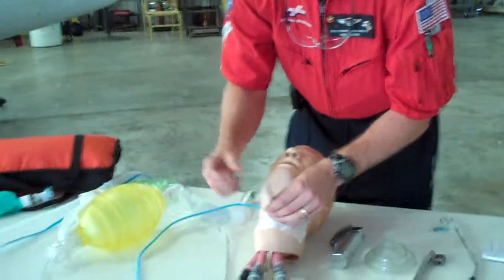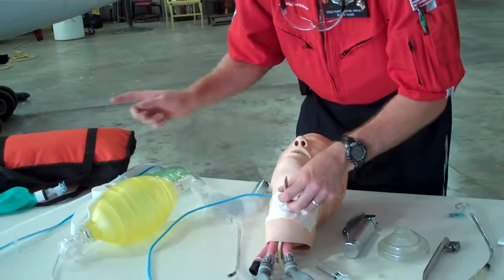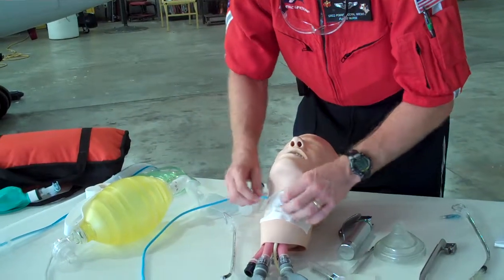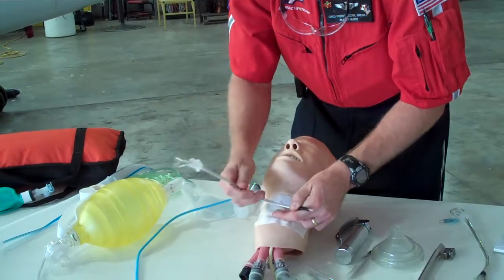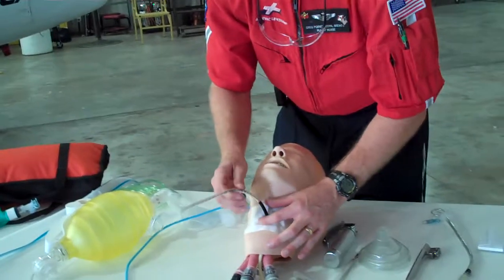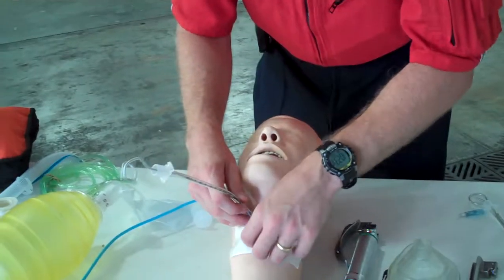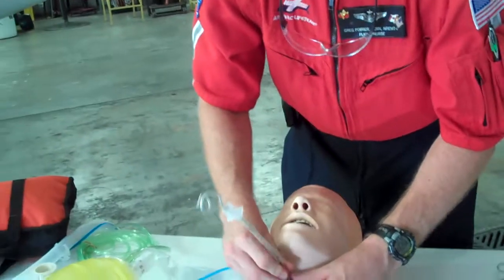So let's just say I have a set of hemostats in position. I'll get a pair and show you after. I could remove the scalpel, making sure that it's kept away from the team. I would open my hemostats to expose the opening, and I would take my endotracheal tube. You can do a cuff tube or a non-cuff tube, and you'd place this into the patient's airway. You would go down just like you would when you're intubating a patient, getting that black line on all tubes past the vocal cords.